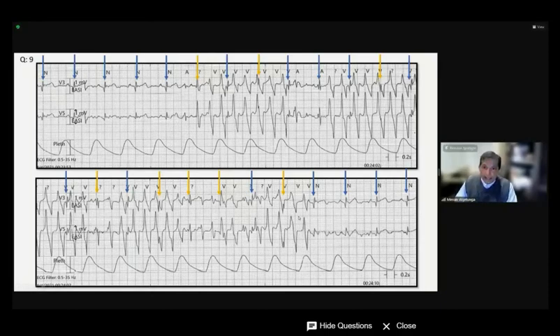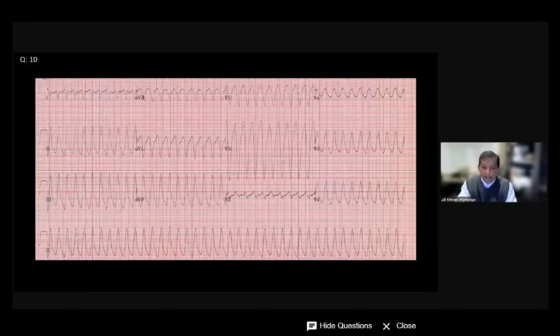And then the last question is this. I thought for interest's sake, I'd finish this presentation here. Please put that up. This is a patient I've seen some time ago, so this is a paper ECG I had to copy. It's a 24-year-old man. This is totally a different question. With no cardiac history, he presented to the emergency room with sustained palpitations and near syncope.